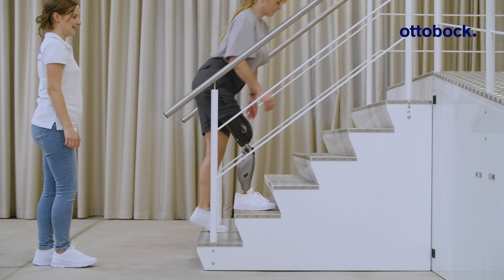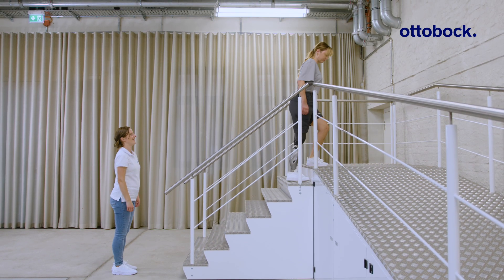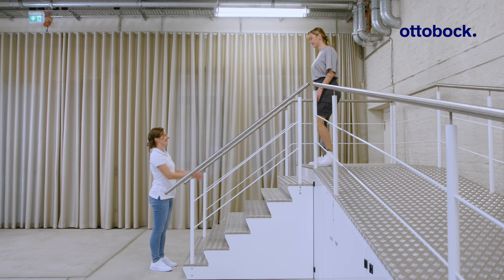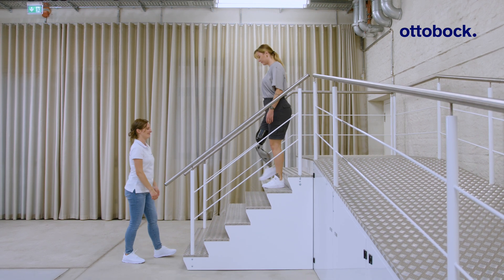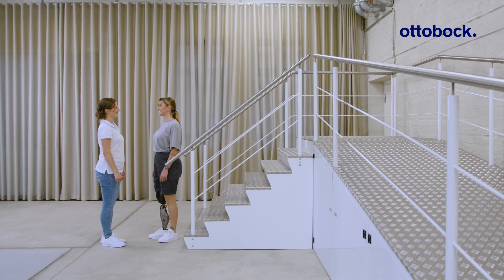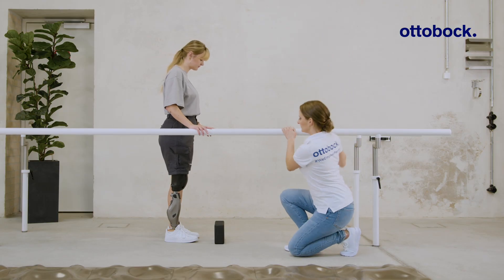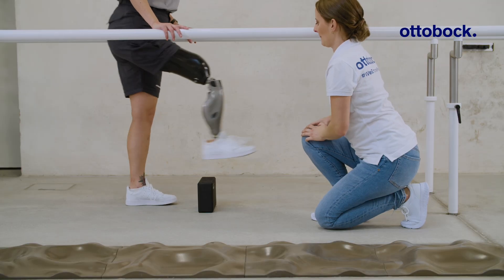Climbing stairs step over step without a handrail is a challenge that requires strong muscles and exceptional balance. Triggering the obstacle function while walking or without a handrail is more demanding.